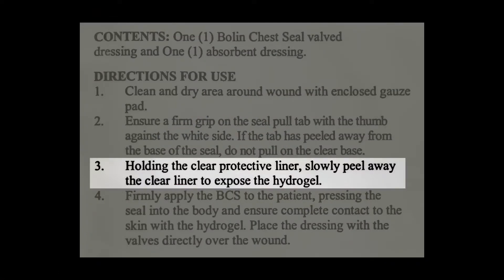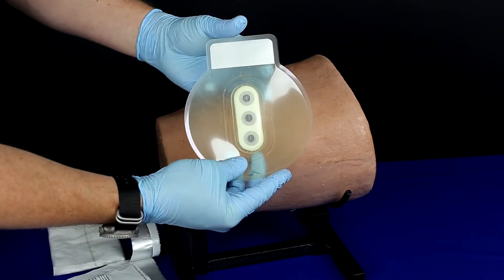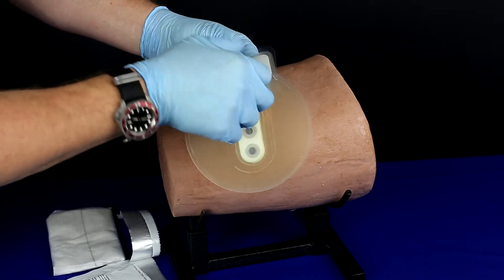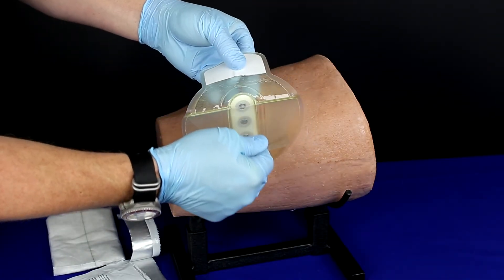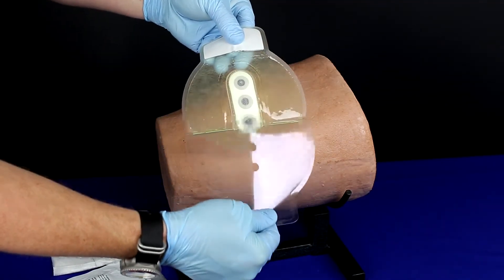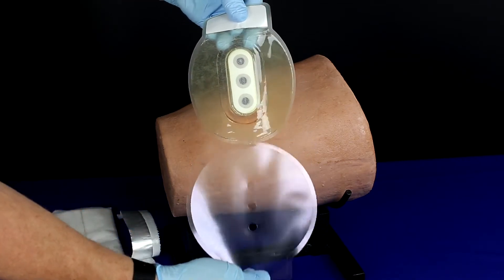Holding the clear protective liner, slowly peel away the clear liner to expose the hydrogel. Carefully peel the protective liner away from the chest seal. Use caution to avoid touching the adhesive surface or allowing the seal to touch the patient or another object.